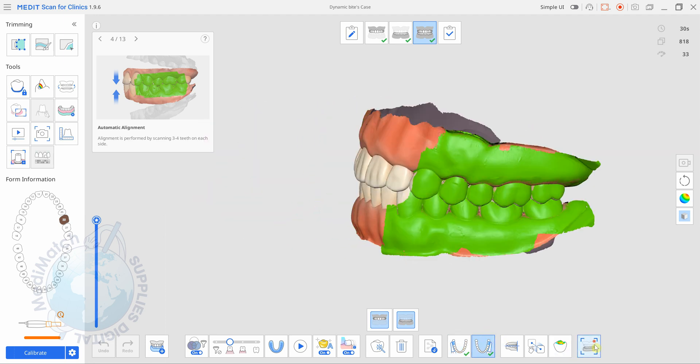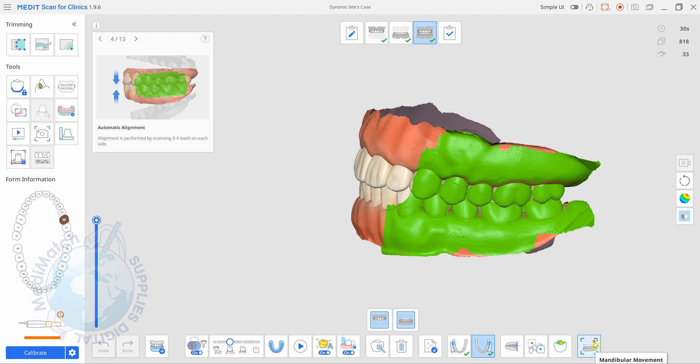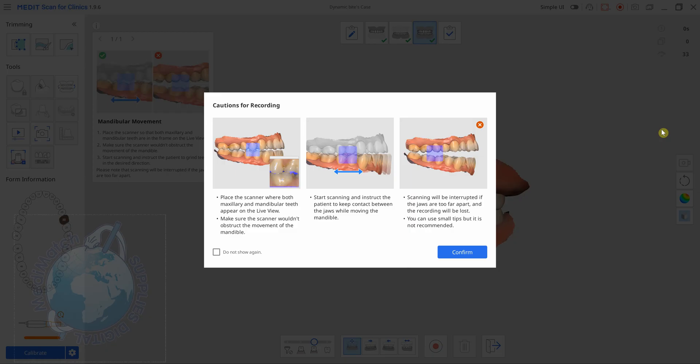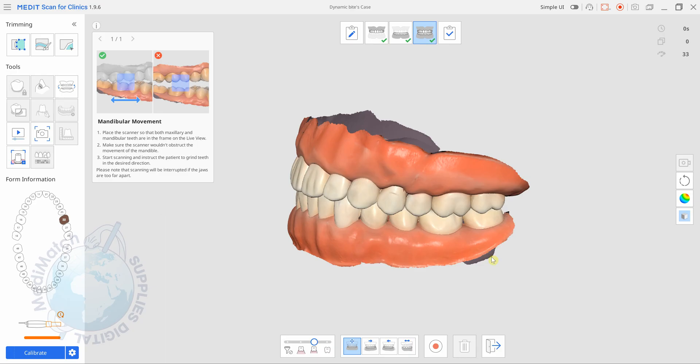In the bottom right hand corner we've got our mandibular movement button. So if we click on it here, it gives us a few tips. Basically the teeth need to be together when you start scanning and if you drift too far apart the scanner will lose its position. So we press confirm.